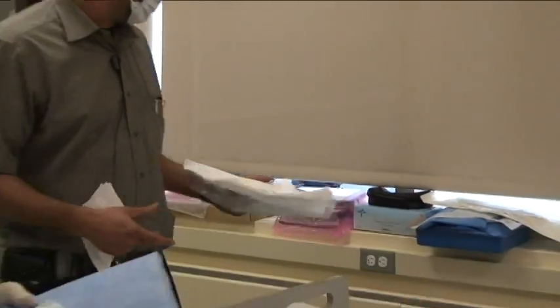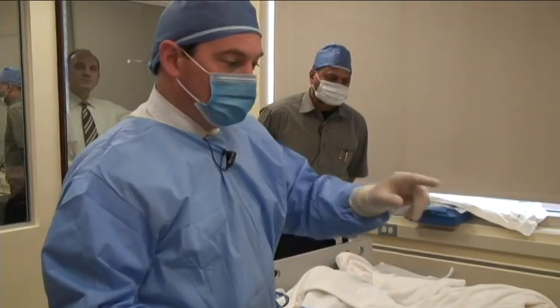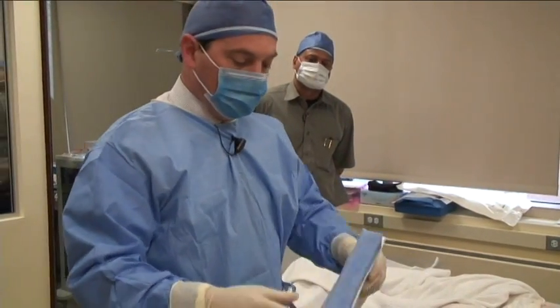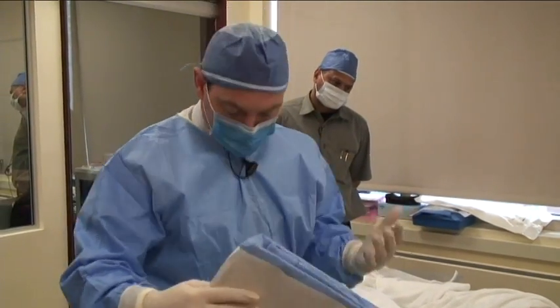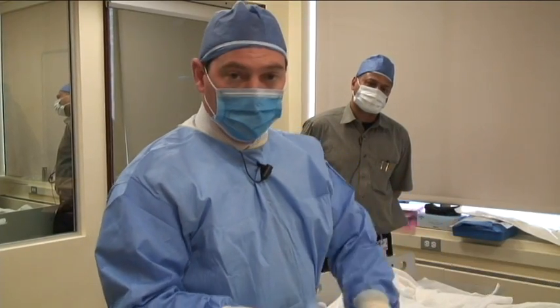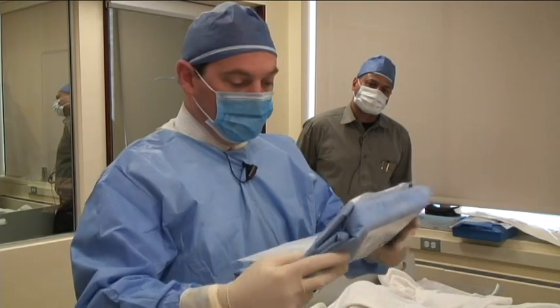This is the Cook pneumothorax kit. It's a 14 French catheter with a pigtail, and I'm going to show you the kit in detail as I open it up. But first, I'd like to do a full sterile gown and drape on the patient. So I've already put on my sterile gown and gloves, and the patient has been appropriately cleaned with chlorhexidine. I'm now going to put the patient cover on him.